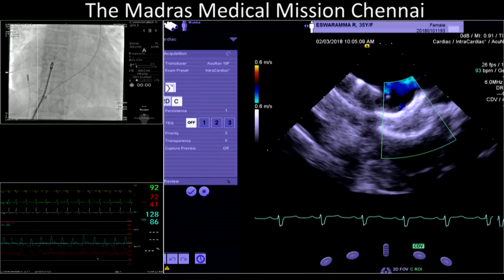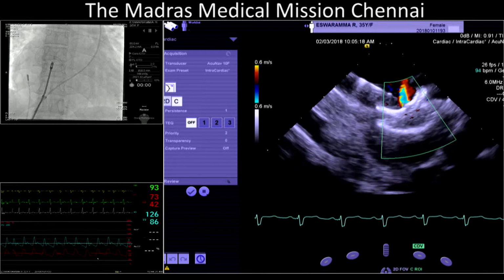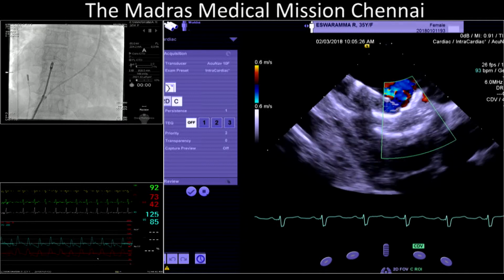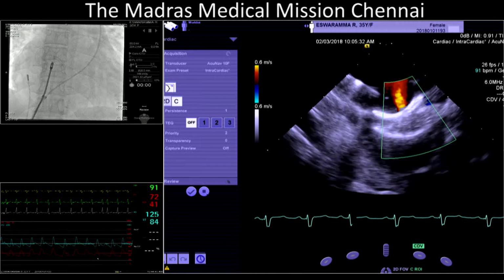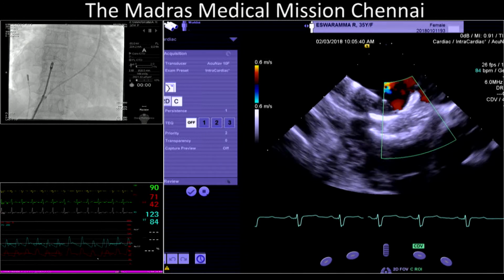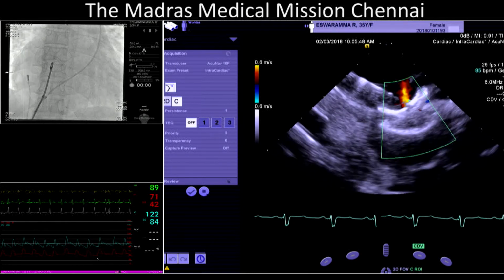Okay. Shiva, you're live. Zahid, we had metoprolol and amiodarone induced sinus bradycardia with junctional rhythm. Right now the patient is on and off, coming back into sinus rhythm. You can see that there are times at which she is in junctional rhythm and times at which she is coming back to sinus. The pulmonary artery pressure is about 53 mean, and the aorta is 97 mean. The intracardiac echo is showing the left-to-right flow, and we are just getting ready to release the device.